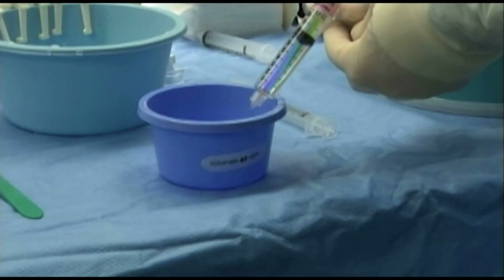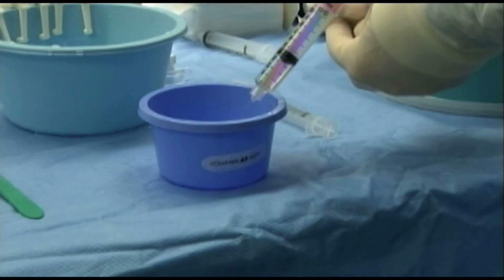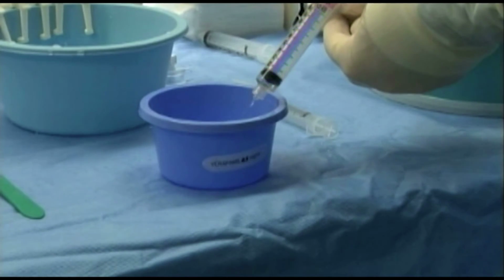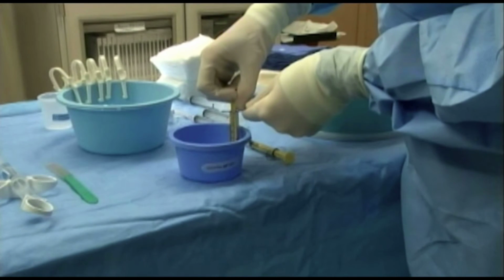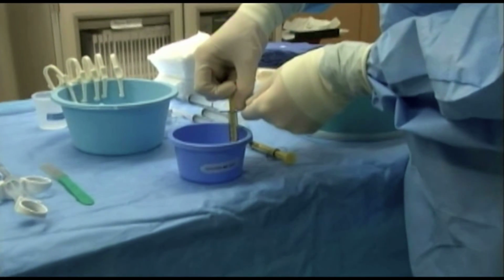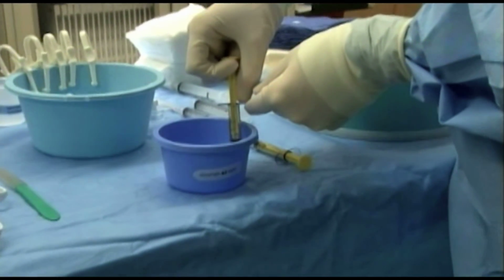Our choice between angioplasty and verapamil is determined by the vascular territory affected by vasospasm. Vasospasm that is exclusively distal is treated by verapamil. Vasospasm that is proximal is typically treated first by verapamil and then by balloon angioplasty if needed. Proximal and distal vasospasm also requires a combination of both modalities.